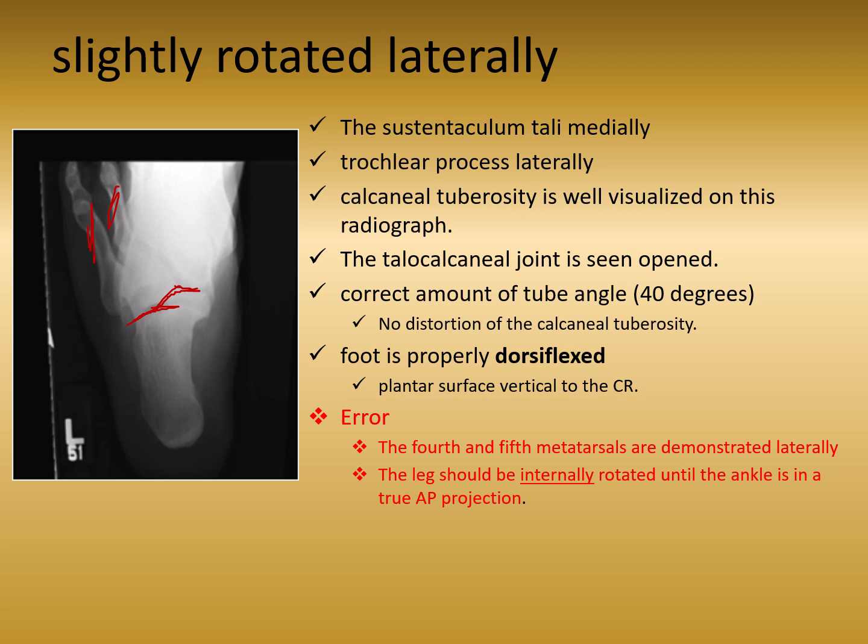But because of that rotation, let me erase this off because I want you to be able to really hone in on this sustentaculum tali. It's all right. It's not too bad. I mean, it's still there, right? It's still in profile. Not as pretty as the last one, but we can see it in profile.